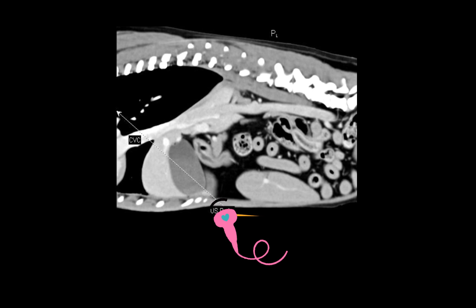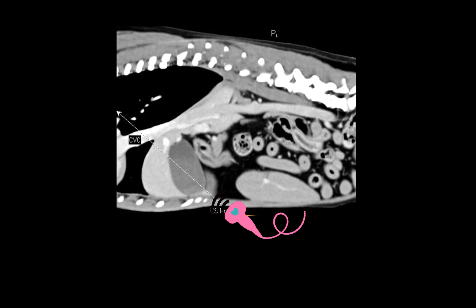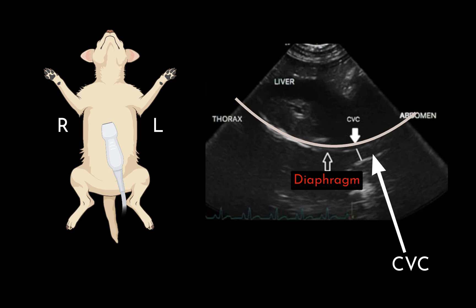To image the CVC at the subxiphoid site, the transducer is placed longitudinally under the xiphoid process and angled cranially to visualize the diaphragm. The ultrasound probe is fanned to the right of the midline until the CVC is identified at the point where it crosses the diaphragm.